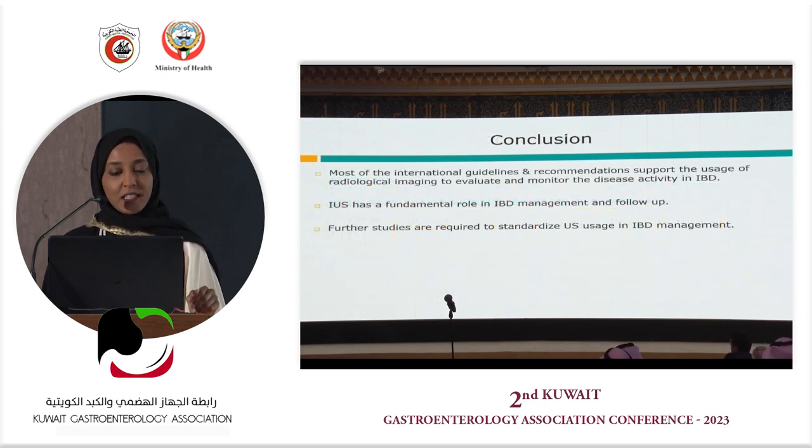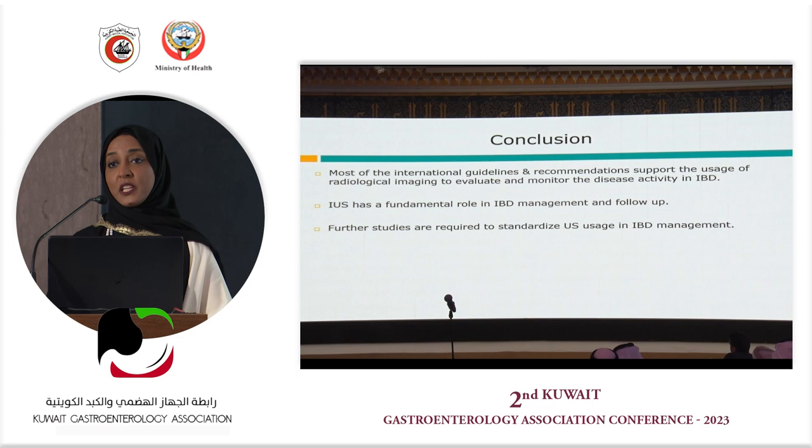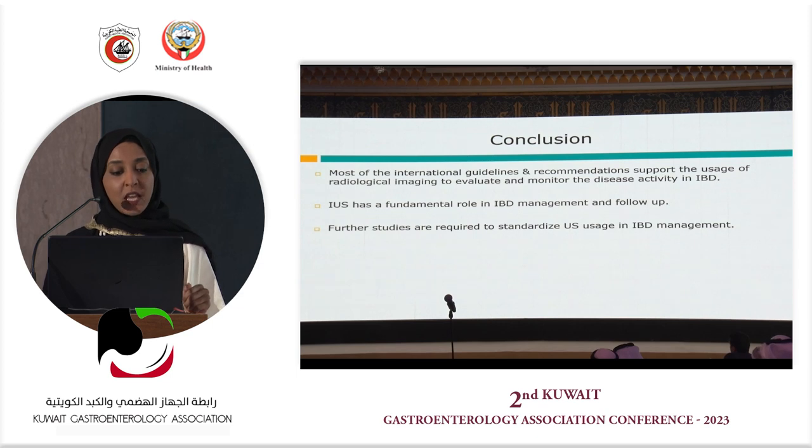So at the end, most of the international guidelines and recommendations now support and include the usage of radiological imaging in managing our IBD patients. They included ultrasound as part of the investigational modalities. Intestinal ultrasound has a really good fundamental role in identifying and following up patients. And for sure, we need further studies and publications to standardize the usage of ultrasound.